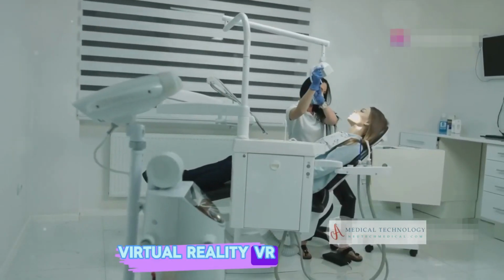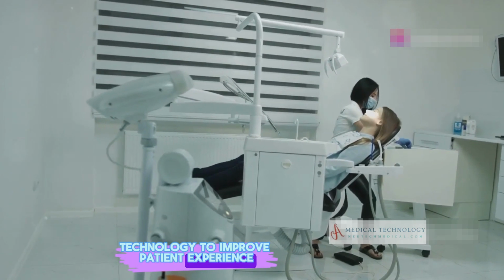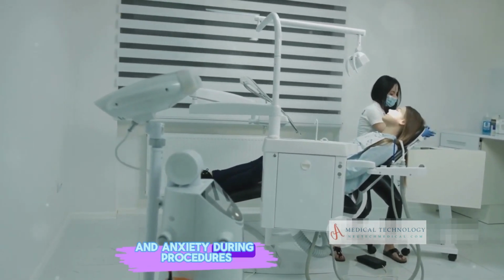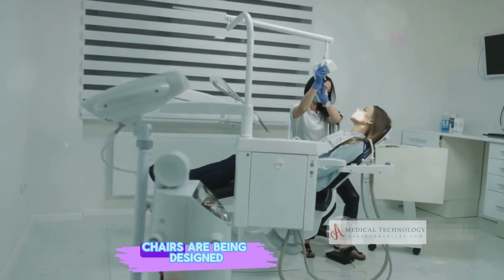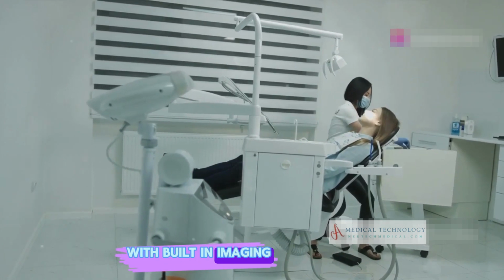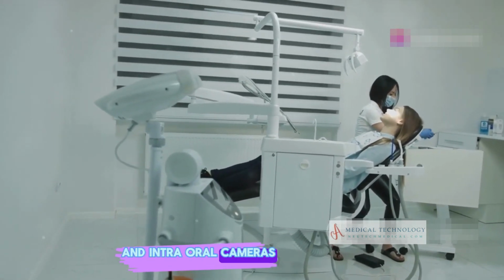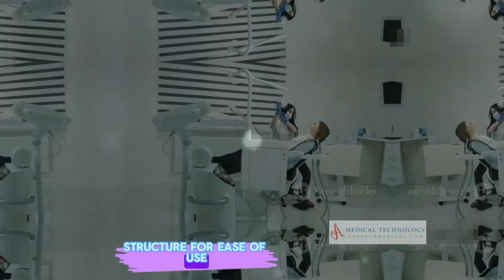Virtual reality (VR). Some dental chairs incorporate VR technology to improve patient experience by providing immersive environments that can distract from pain and anxiety during procedures. Advanced imaging and diagnostic tools. Chairs are being designed with built-in imaging and diagnostic tools like X-ray scanners and intraoral cameras, which are seamlessly integrated into the chair structure for ease of use.